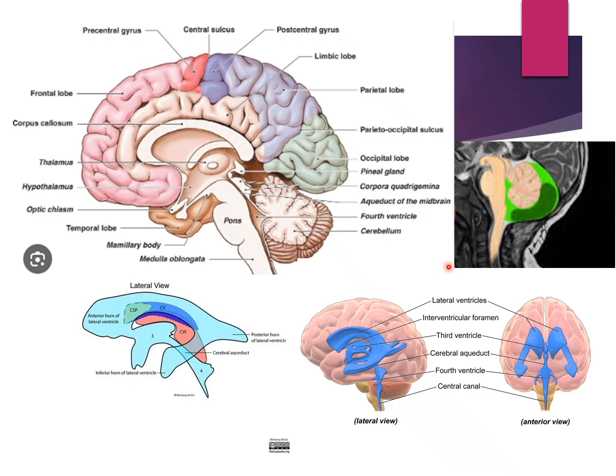And then the other thing I wanted to point out just really quickly is the CSP. It's in that frontal horn of, or near the frontal horn of the lateral ventricle. So keep that in mind. If you guys want to go through and look at these again and kind of look at everything, feel free to do so.